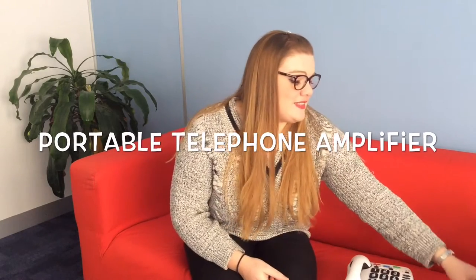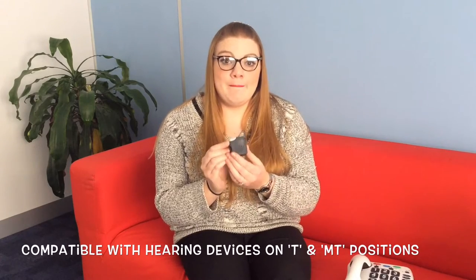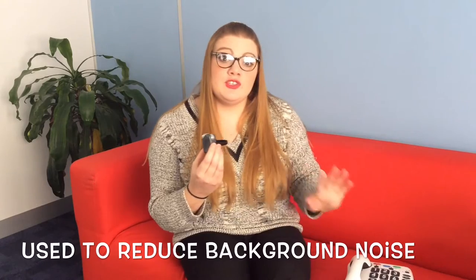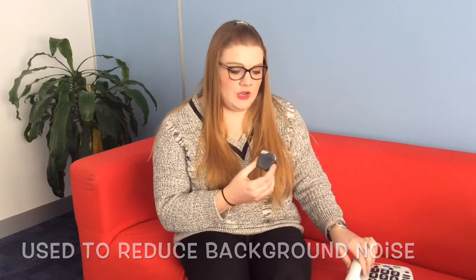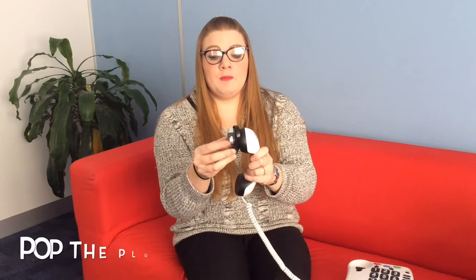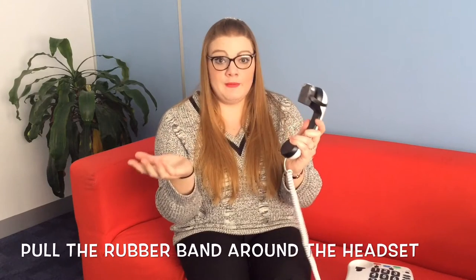Now I'm going to show you the portable telephone amplifier. It's a really small but nifty piece of kit, and it is compatible with hearing devices when set to the T or MT position. It's used predominantly to minimise background noise. I'll use the phone I just showed you to demonstrate. At the back there's a little plug — make sure the rubber band is pointed upwards, pop the plug into the headpiece and secure it, then pop the rubber band around the handset and you're good to go.